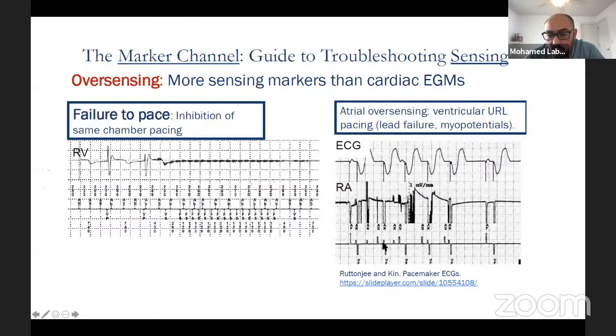So the device will have a lot of spikes, and this is actually not atrial activity. So the device will say, a lot of activity is happening in the atrium, I better catch up to it and pace in the V. So now you are tracking an artifact and pacing unnecessarily in the ventricle at a higher rate. So this is another example of oversensing.